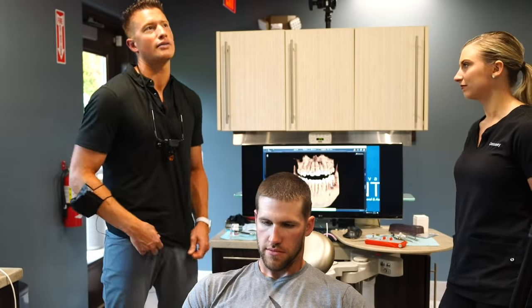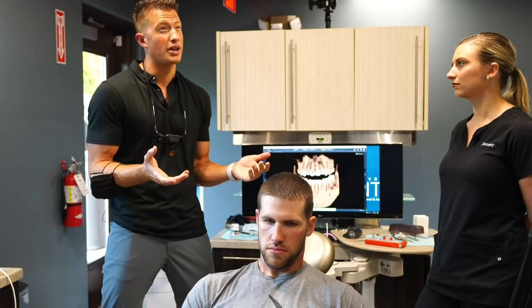There are a couple of different machines out there that do that, and they have to be a cone beam. So cone beam 3D. 3D has to be in the label and it needs to be made by Sirona, by the way. It's kind of like Apple. Apple has the closed system, and everything within their system they control and make work really well. Sirona is similar in that regard when it comes to dentistry.